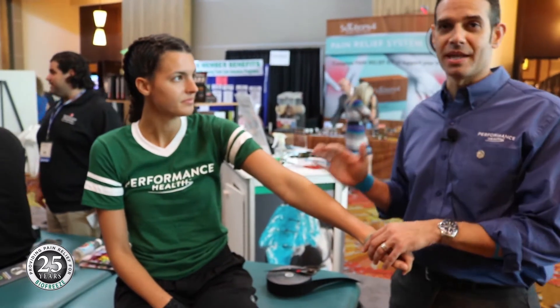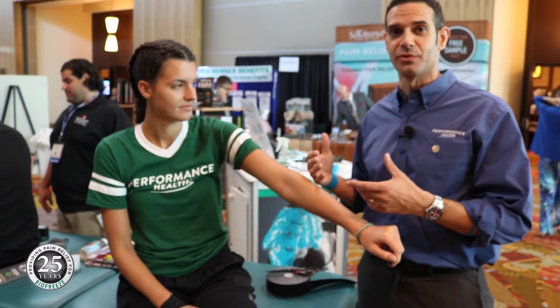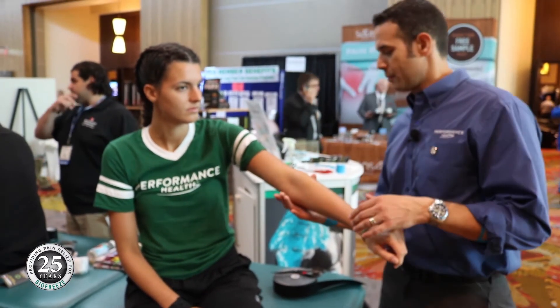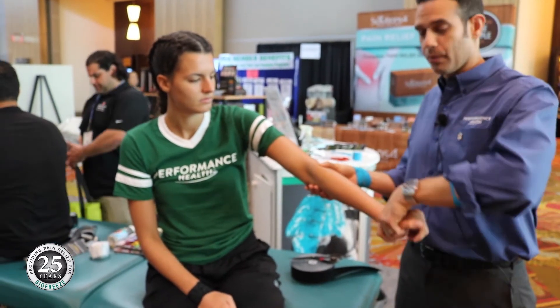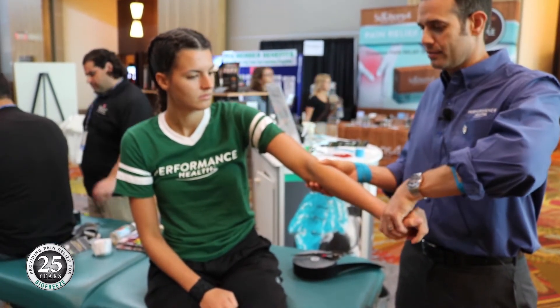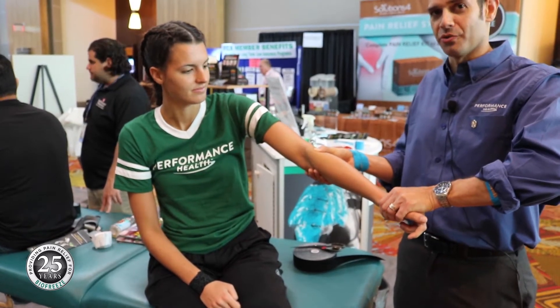So once we know that there's actually pain associated with it, we want to find out if we can pull the skin in a direction that makes it feel better. In particular with her, I'm going to start by pulling the skin towards her and we're going to do the same muscle test again. Hold strong. Ready? And you can tell she's actually a lot stronger when I pull the fascia in that direction.